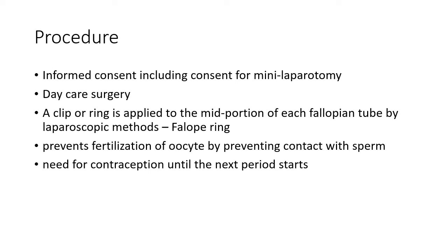Now let us see about the procedure involved in laparoscopic sterilization. Informed consent should be taken from the patient. The consent should include consent for mini laparotomy also. This is because if we have some difficulty during laparoscopic sterilization, we can convert the surgery into mini laparotomy and proceed with sterilization. Laparoscopic sterilization is done as a daycare surgery.